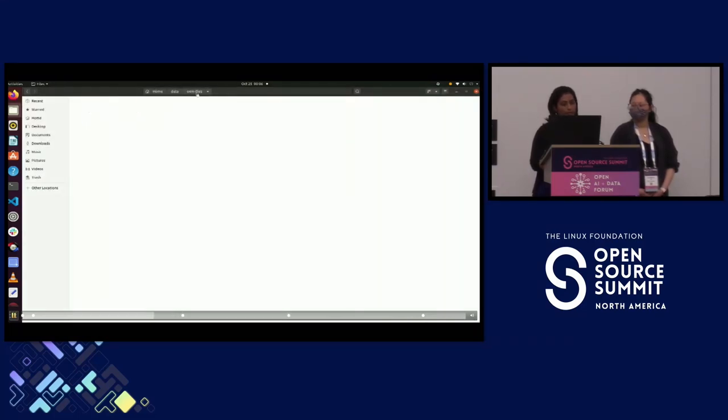Okay. And now, if we look at the gateway file side, we can see all these folders. Input and output will be empty because we have deleted and archived all these images. Now we also have a reject folder there. We didn't reject any images, so that is also empty. Okay.